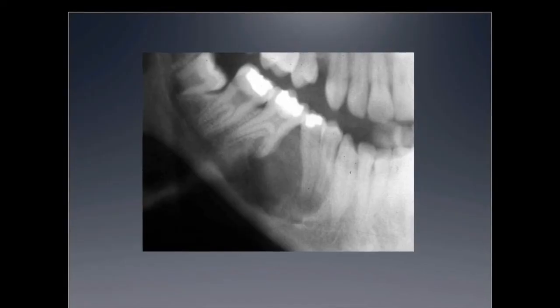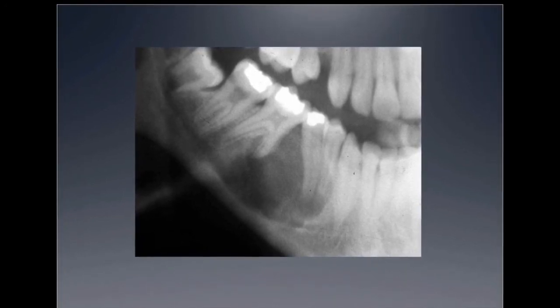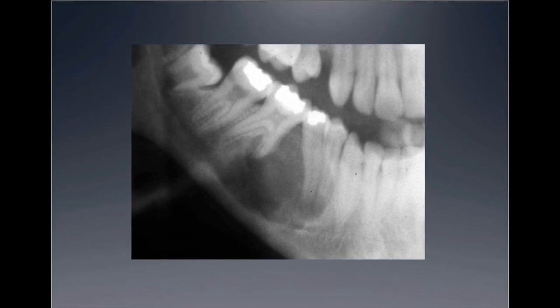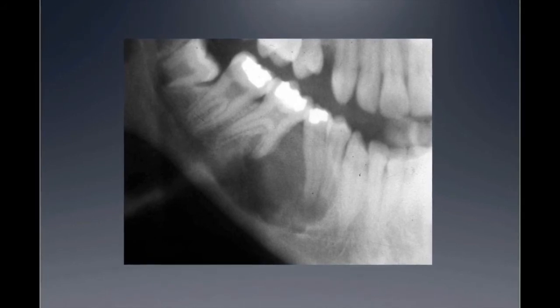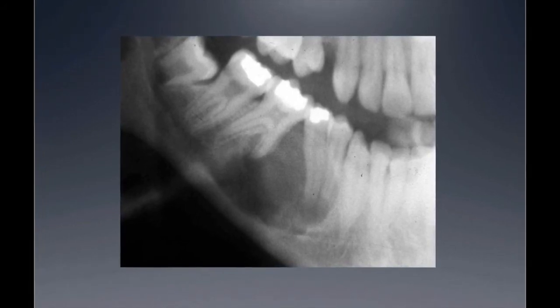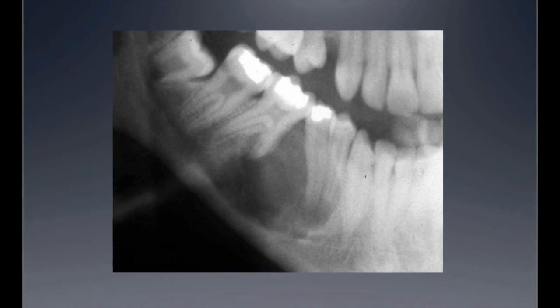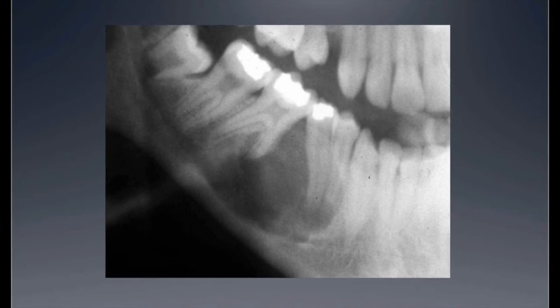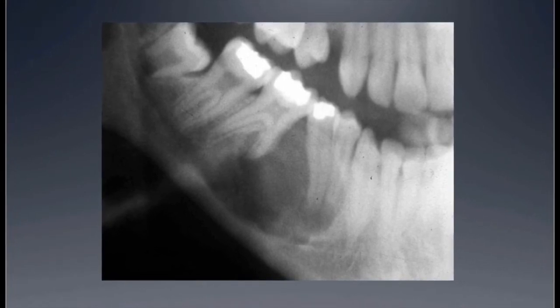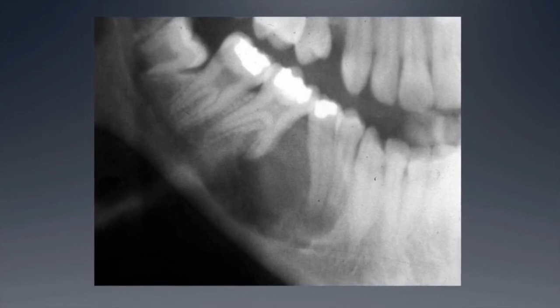Now, this is not likely to be mistaken for a single periapical lesion, but it has some of the characteristics that I want to point out. You could potentially have all the teeth involved dead and creating a huge periapical cyst of inflammatory origin. However, notice the displacement of the teeth. And the expansion. So even if it's a smaller lesion, but you see the expansile nature of it, that's not something that's very common with periapical inflammation. Exactly. So the expansile pushing of the roots apart, that's a telltale sign that I want people to remember.